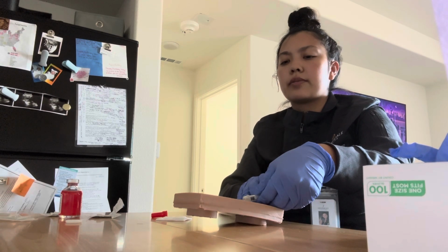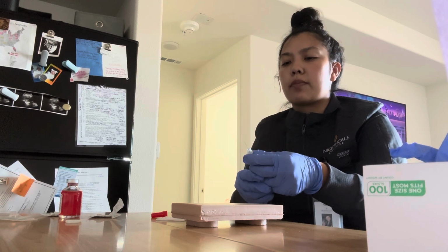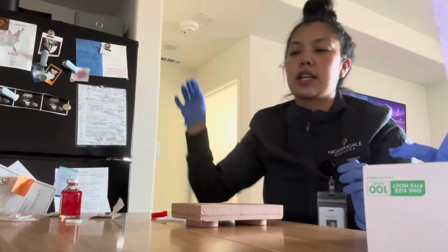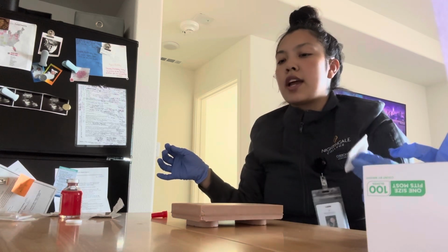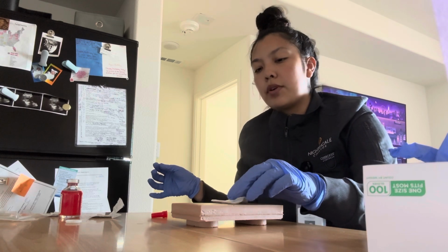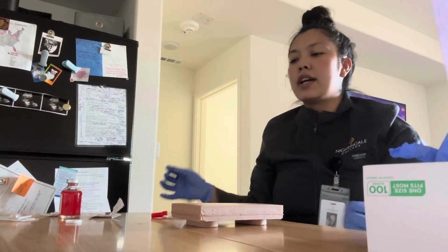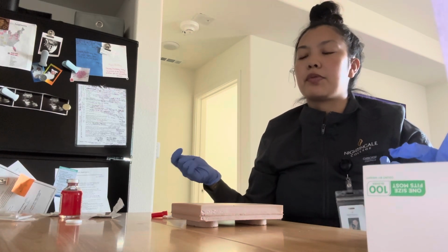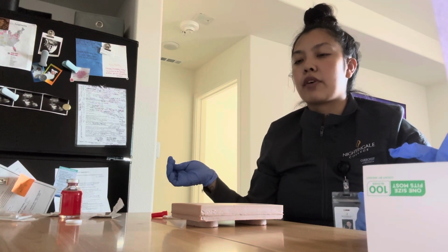Okay, perfect. All right, and then because this is a safety needle, I'm gonna go ahead and push it up. Perfect, and I'm gonna discard of that into a sharps container. Okay, now that I see that there is a bleb, that's perfect. And then I'm also going to make sure that if there's any blood to just dab it, because with a TB test, you don't want to rub the patient's skin because we do need the bleb for the test. The patient will be returning in 48 to 72 hours to see if they are negative or positive.